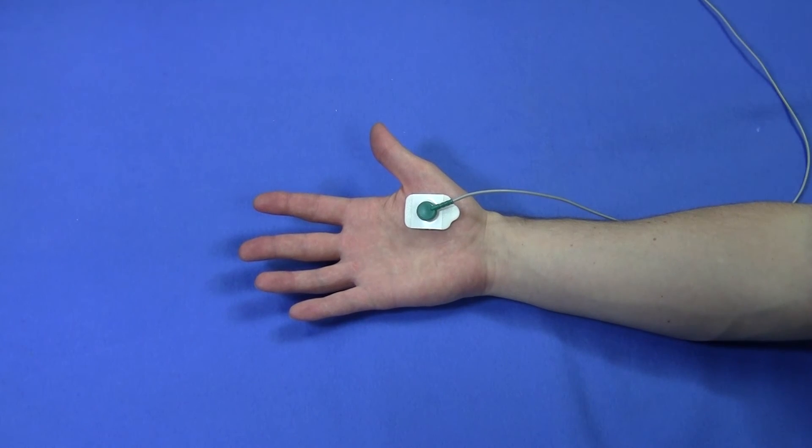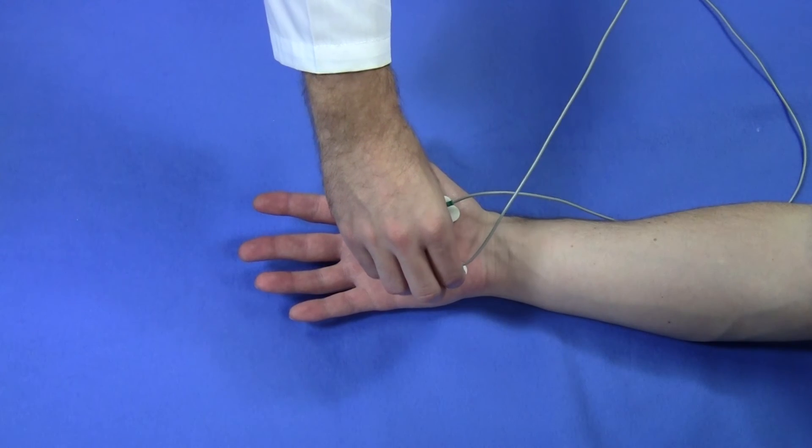I'm going to take another electrode, again with the green wire, and place it on the palm.